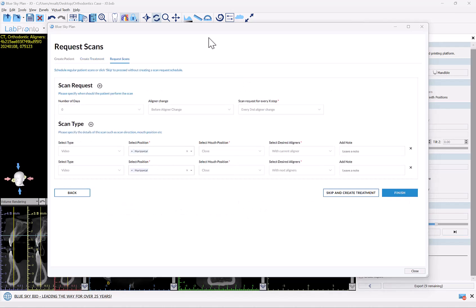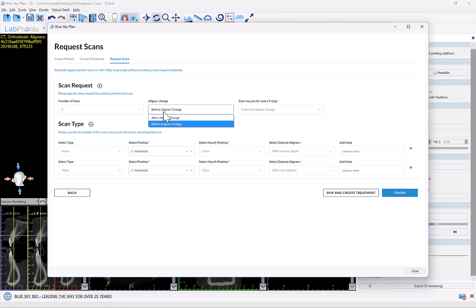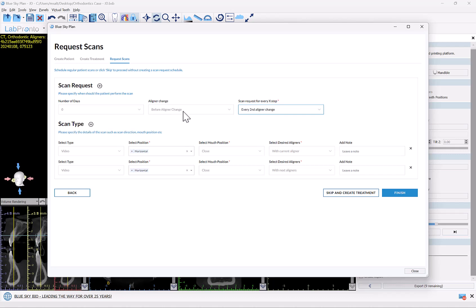Now we're setting up the schedule for the patient scans and what type of scans they will be. We've pre-populated the screen with recommended default settings, which you can review and change. We have a field for number of days — either before or after aligner change — and how often, such as every aligner change or every second aligner change. The default is zero days before the aligner change, every second aligner change, meaning the patient is prompted for a scan every second time they're supposed to change their aligners rather than every time.